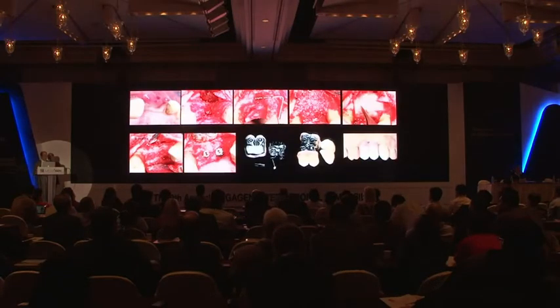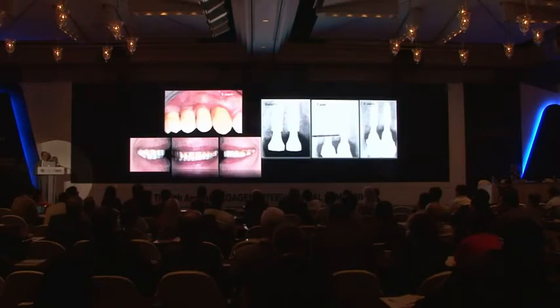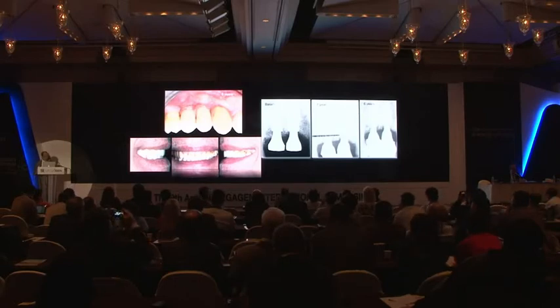It's the case where we extracted the upper right premolars, bone regeneration with BIOS and the absorbable membrane, 6 months after we inserted the implants, completing the rehabilitation after 3 months. The health of the soft tissue is very good 6 years after. We don't have crestal bone loss. Even better, we have a growth of the bone on the platform, even if you can notice on the RX that the inter-implant distance is less than 2 millimeters.